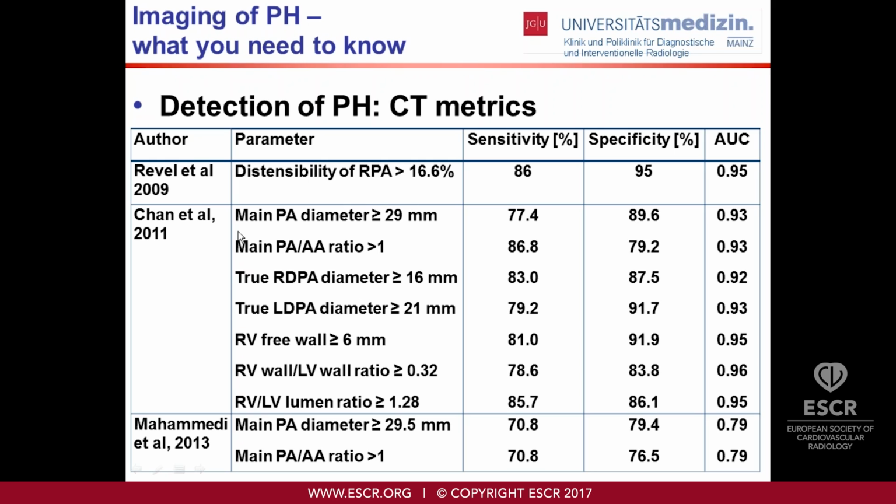I think there are studies coming up showing us that this might be very, very important and might be replacing, for example, VQ scanning in the near future. And I also want to show you later on in how far we can get with phase contrast imaging, and in its latest variant, the 4D phase contrast MR imaging techniques.